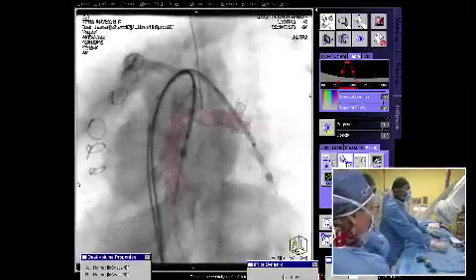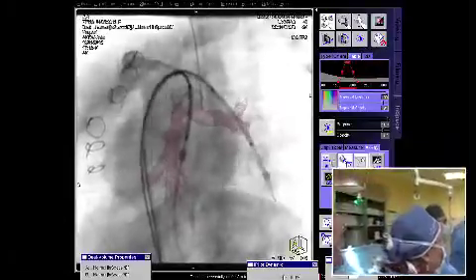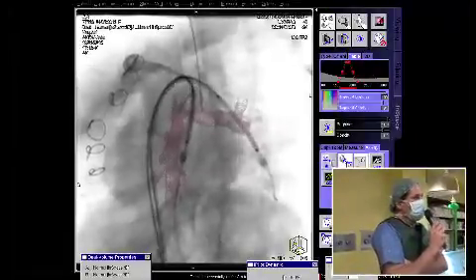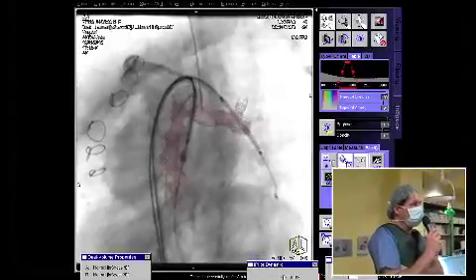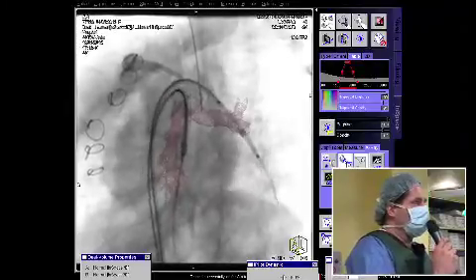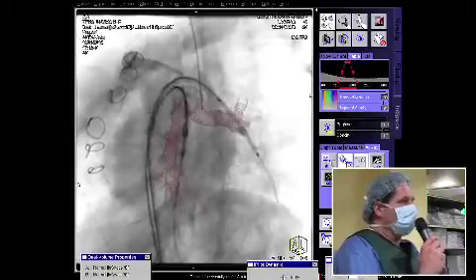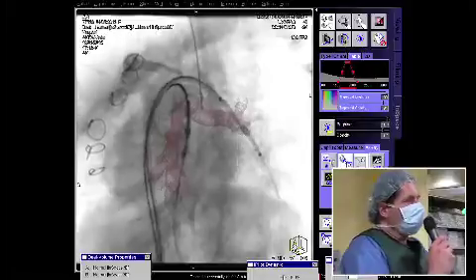May I give a short comment on the iPilot now, which is the roadmap? So, John, you said yes, it could be helpful to choose the right angle, but to be honest, due to the big sheaths and the wires and the stents and the balloons, we have so much stiff material in the child that in this situation, every roadmap derived from 3D imaging before is without any value. So I think to get the strategy, we can choose the right level of stenosis to treat.